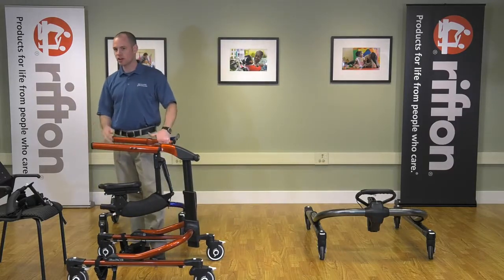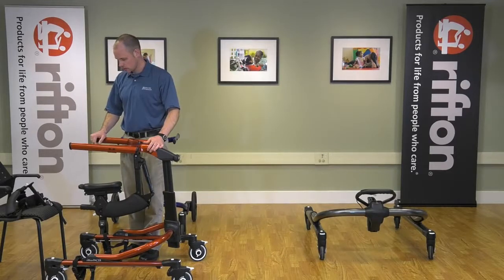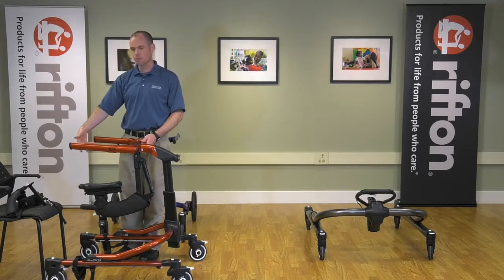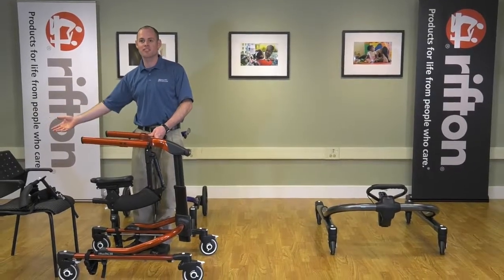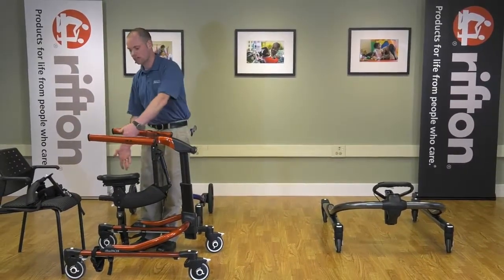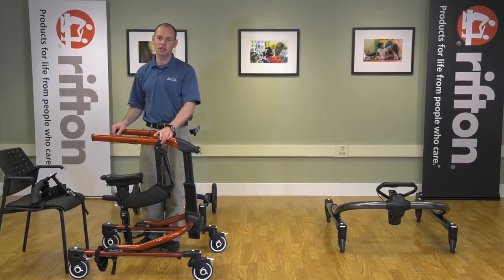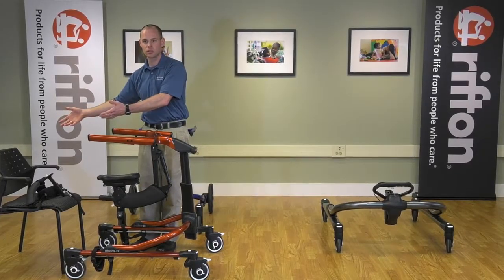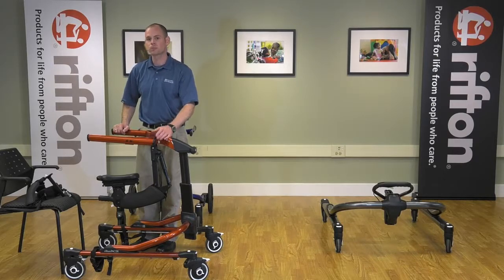If the base doesn't fit around a chair, the closest you could get the client is like I showed you, and you just have to help them onto the seat. You can adjust with the multi-position height adjust to the best position for that, but you would have to help them out of their wheelchair if the base doesn't go around the wheelchair. So that would just take, I guess, a couple therapists helping the client from the wheelchair onto the dynamic pacer. Does that make sense?